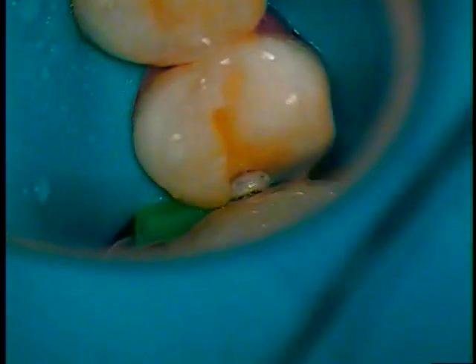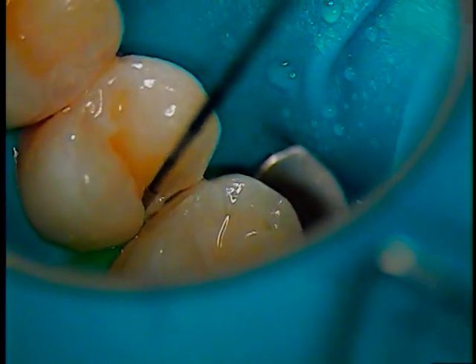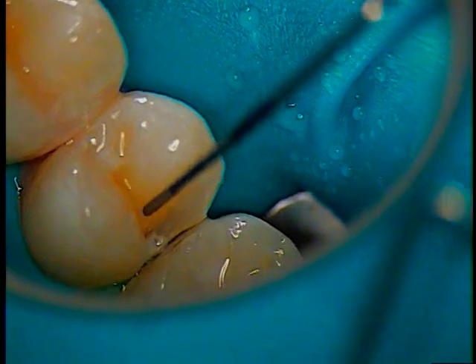Now I'm coming up against the axial wall, and I'm going to develop that a little bit more, and I'm going to trial in a condenser. I'm just going to see how that goes into this area. Now, while we're getting that instrument, I'll take a perio probe and measure the depth. Okay, so we're about 3 millimeters in depth from the pulpal floor.